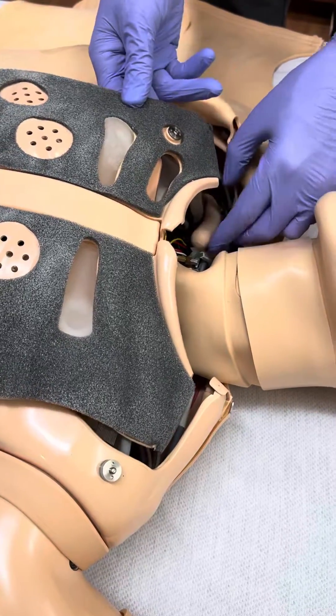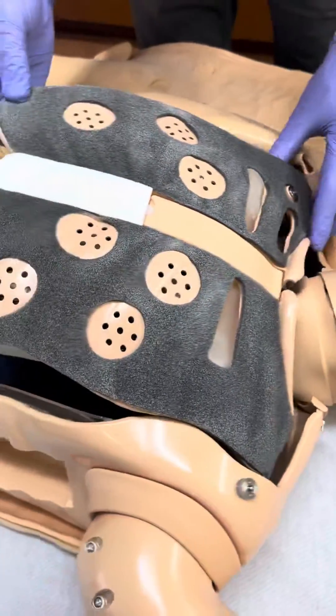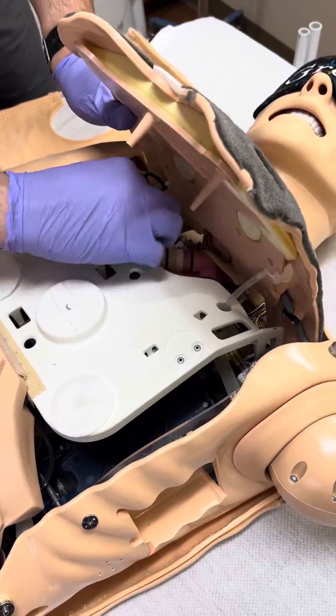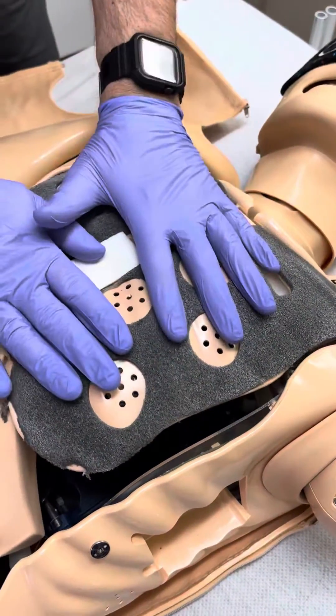I had to tuck it behind the chest tube hose. The hoses go back on and the chest wall plate sits down into place.